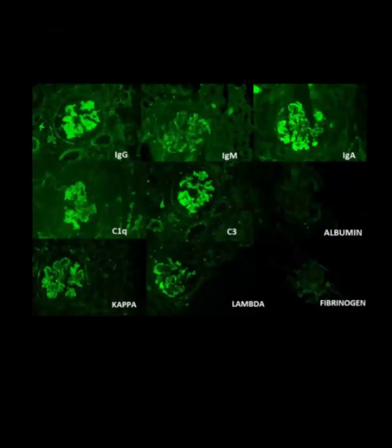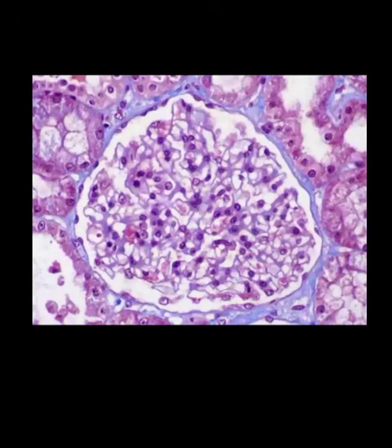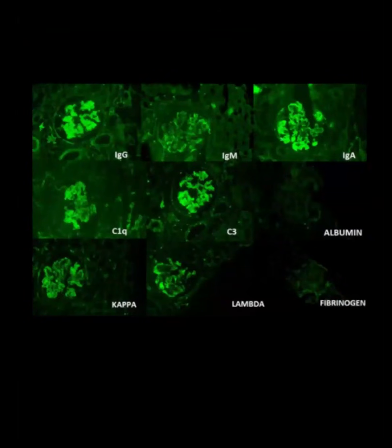So again, here you can see IgG is present, IgA is present, C3 and C1q and kappa are present. So which disease can it be? Lambda is also present. So it is again full house. This is going with lupus. IgG, IgM, IgA, C1q, C3, kappa and lambda. It can be full house. Yes, it can be lupus nephritis.